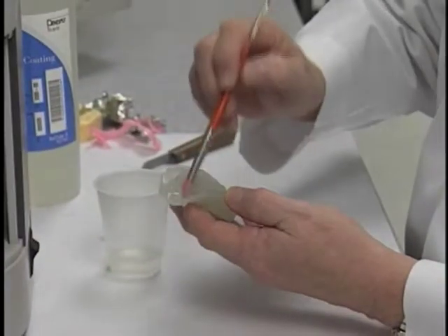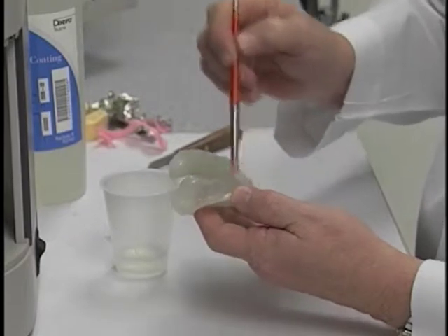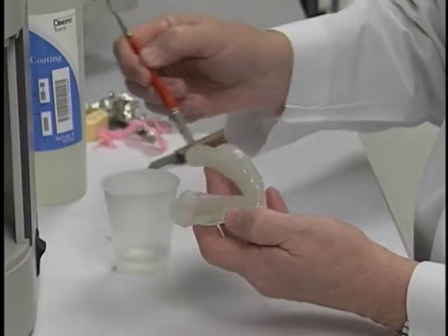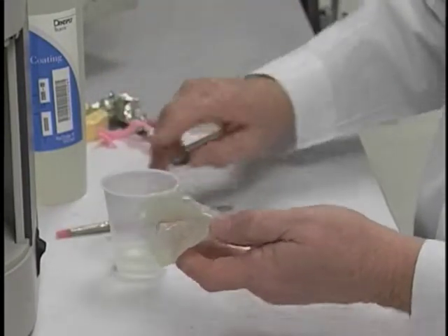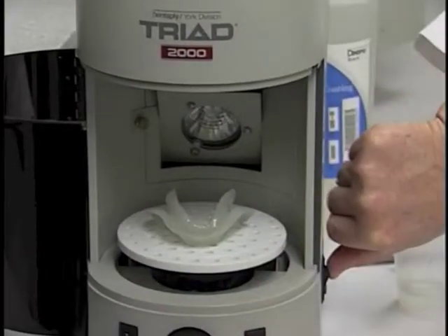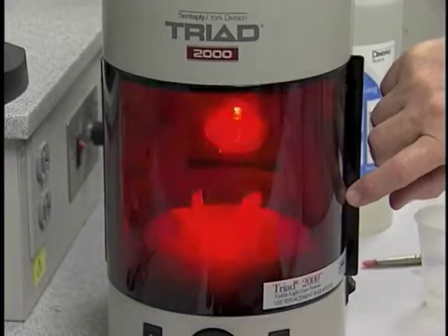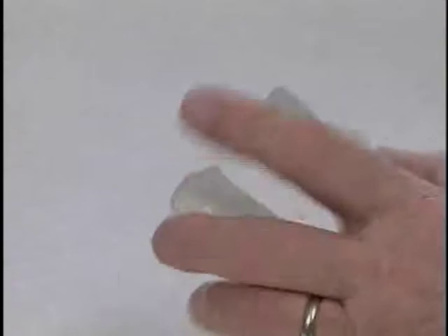And now we paint the internal surface of the tray with the air barrier. Once that has been painted, we put it back into the unit once again. Start the unit for 4 minutes. And we're going to do the same now with the mandibular tray.